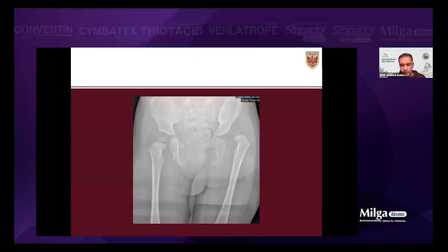So yeah, I asked for straight osteotome and curved osteotome, half-inch lamina spreader. I asked for Garrison, number 3, and periosteal elevators, K-wires, and small fragment plate and the C-arm. Any comments before we go to the surgical technique?